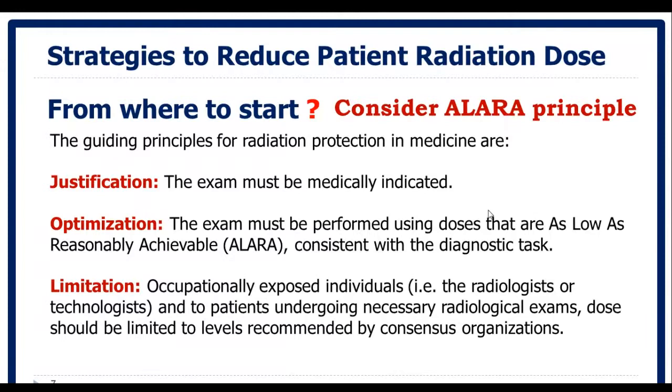Okay, this is actually done through a patient audit or by using phantom-based measurement in order to start the service. And this is in the quality assurance, it is related to the initial quality control testing.